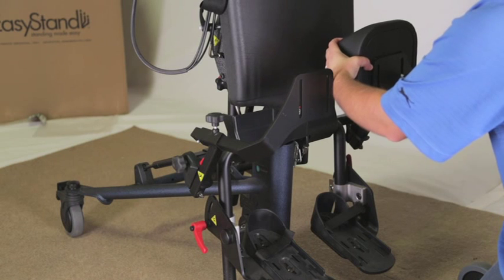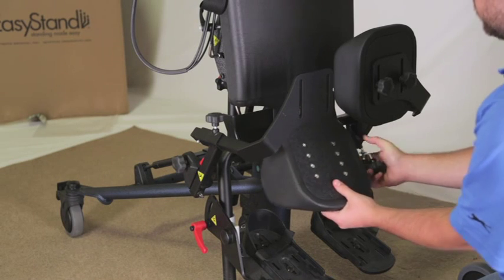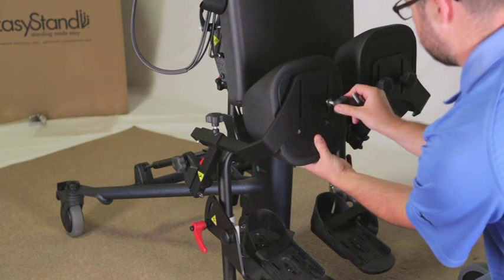Remove knobs from the knee pads. Place the knee pads on the bracket with the larger end of the pad to the outside and the seam side down. Place into the desired position and tighten securely.